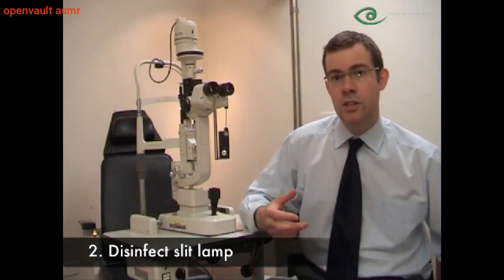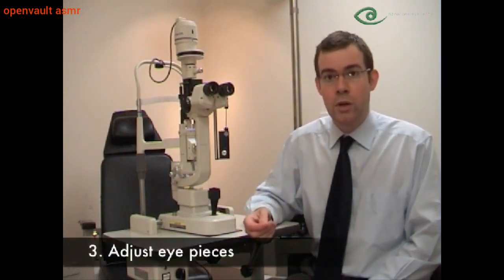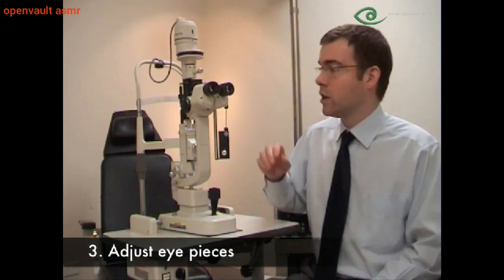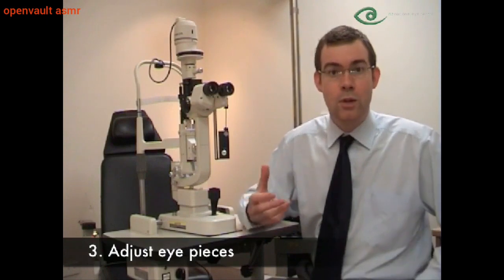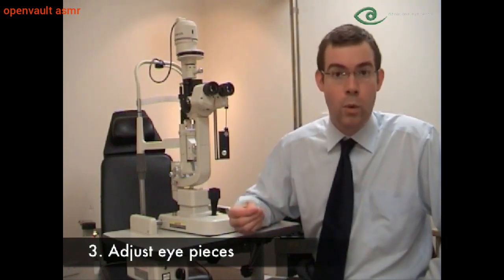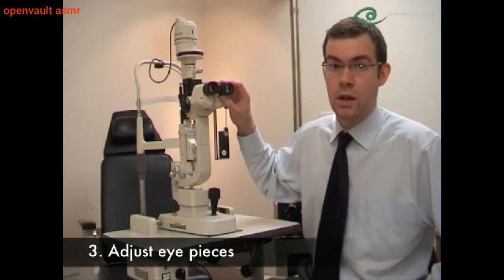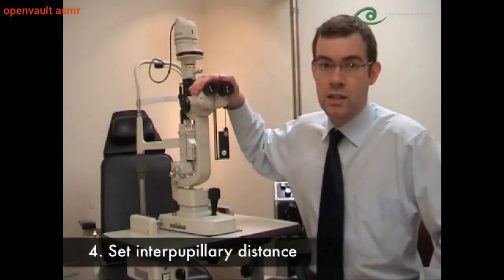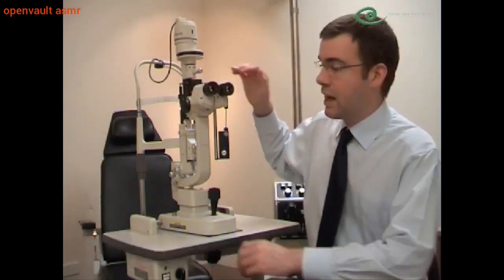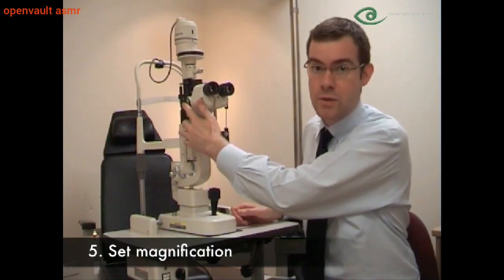The next step is to get the slit lamp ready to use, starting with the eyepieces. If you don't have a refractive error or you're wearing glasses or contacts, you should set each eyepiece to 0. If, however, like me, you have a refractive error and you're not wearing glasses or contacts, you should dial your refractive error into each eyepiece. You then want to set the interpupillary distance so that it's comfortable for you, and select magnification, initially a low magnification such as 10 times.